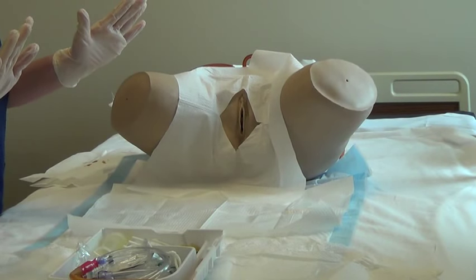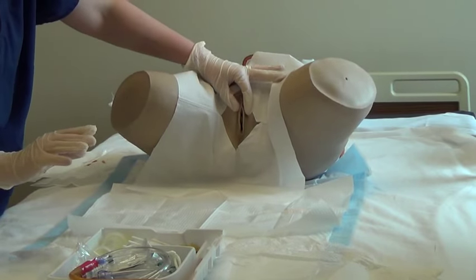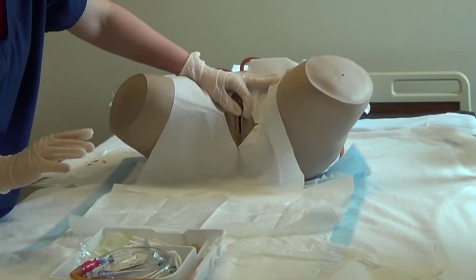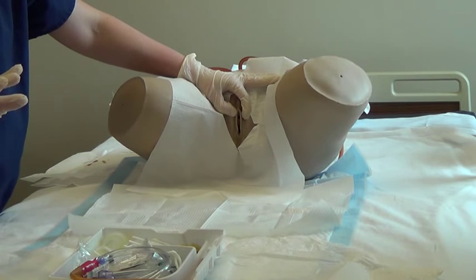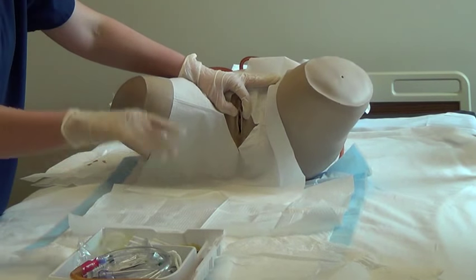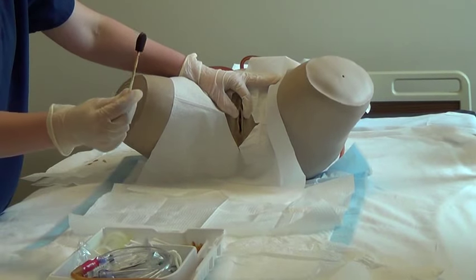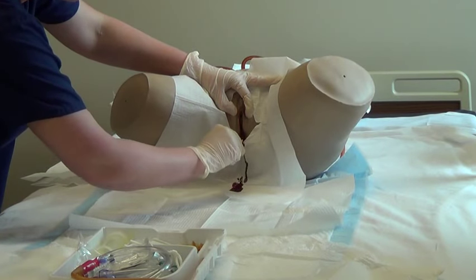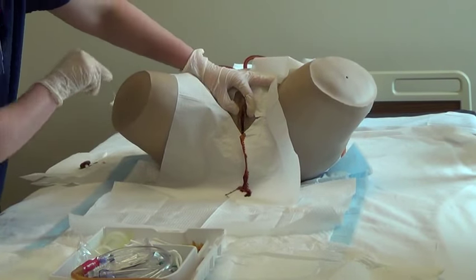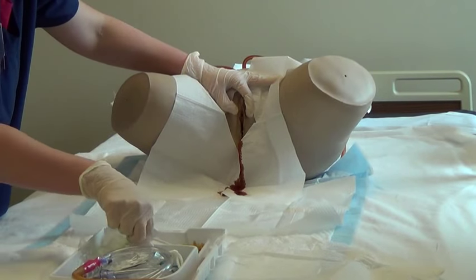For females, with your non-dominant hand, carefully retract the labia to expose the urethral meatus. This hand is now considered contaminated and is committed to non-sterile activity. Using your dominant hand, twist the first swab stick to remove it from the tray and cleanse the labia minora furthest from you using one downward stroke. Repeat with the second swab stick to the labia minora closest to you.